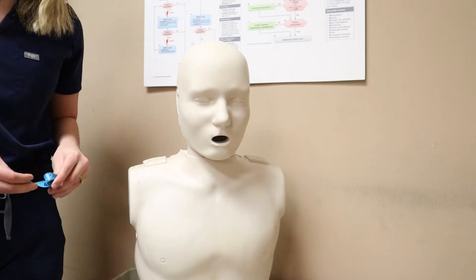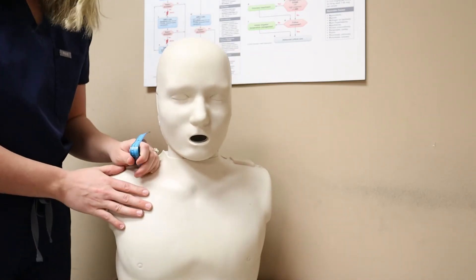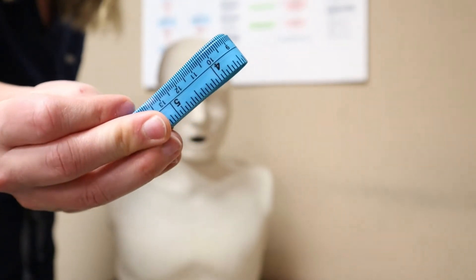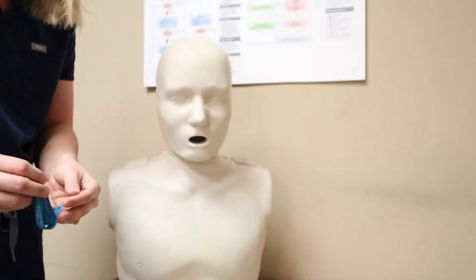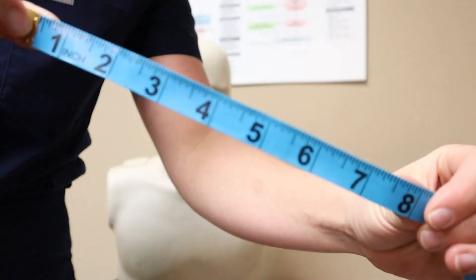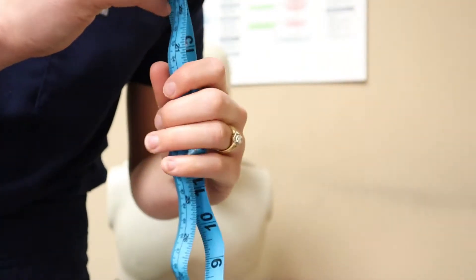So finally, let's get into the measurement of the NG tube and how you do that and where to measure from. We are going to use the method that I learned in nursing school and that I was still doing in the hospital that I practiced at. I am using a tape measure today, but you will be using an actual NG tube, which will work just fine because on your NG tube you will have measurements just like a tape measure, which will help you determine how long your NG tube needs to be.